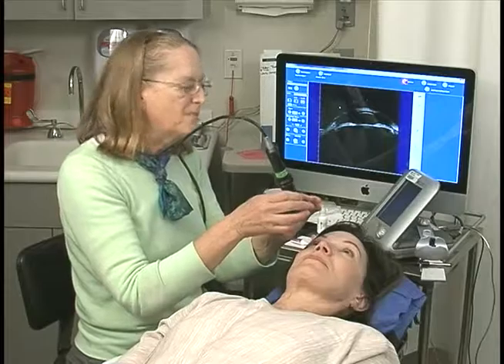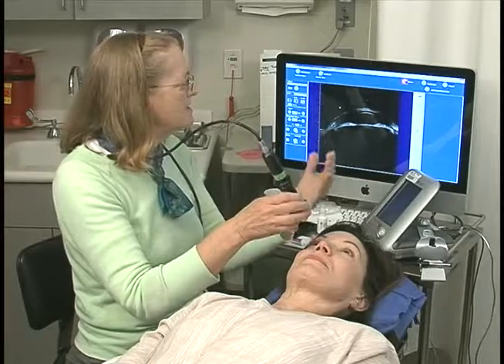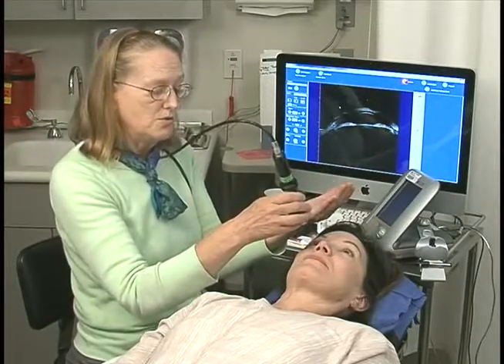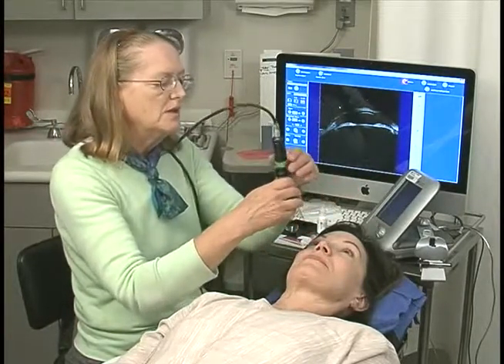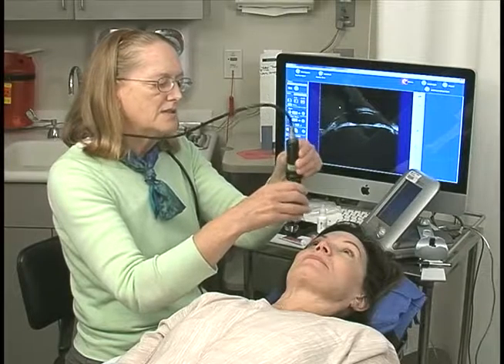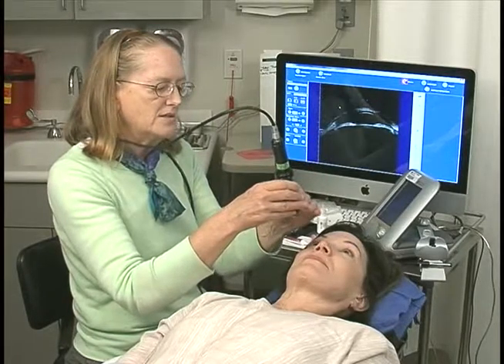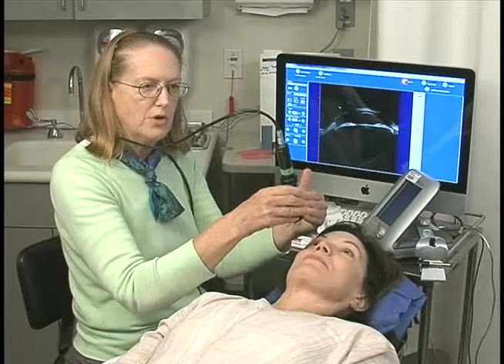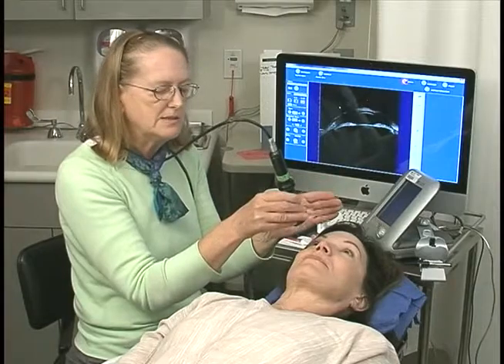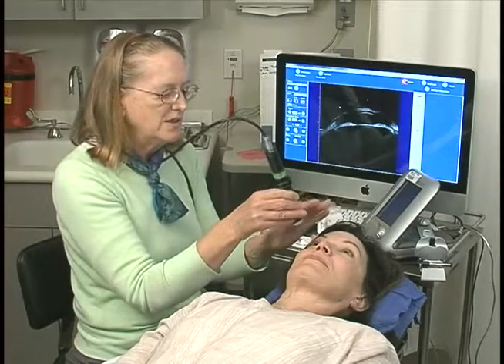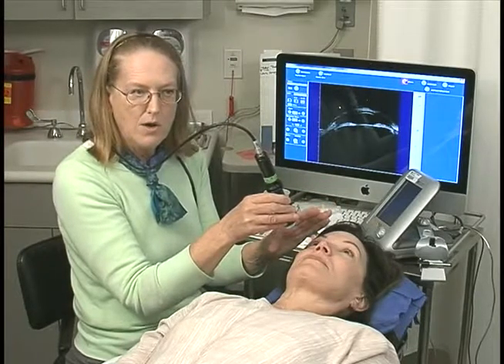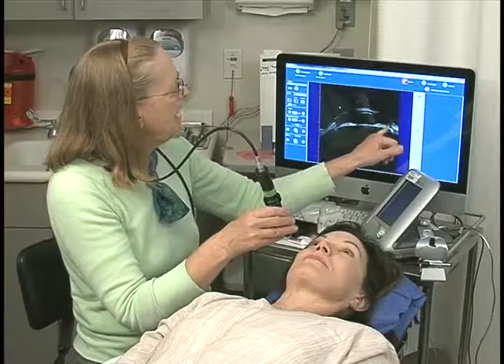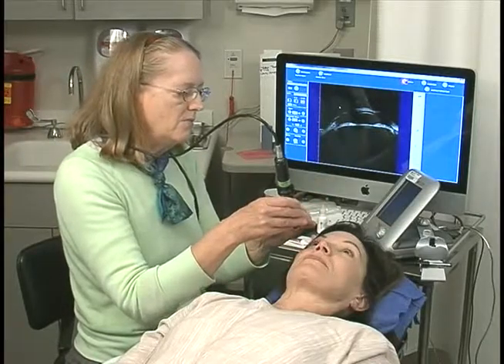So from the beginning, it's nice to do an axial scan — I usually do horizontal. In other cases, such as positioning of an implant, it's important to do verticals and obliques in the event that an IOL has shifted.